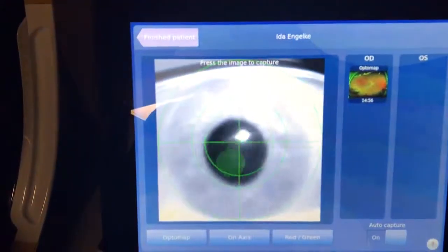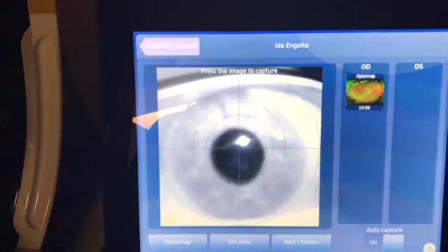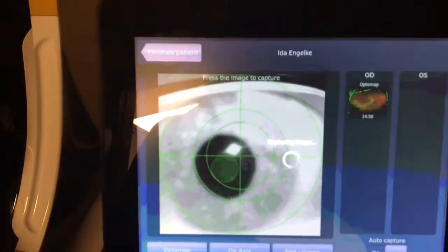Go ahead and put your left eye in that hole now, and you want to get in the center of that circle. Open big and push in until it's green. If it's red, you went too far — make sure you're really centered good. Good job, you can sit back now.